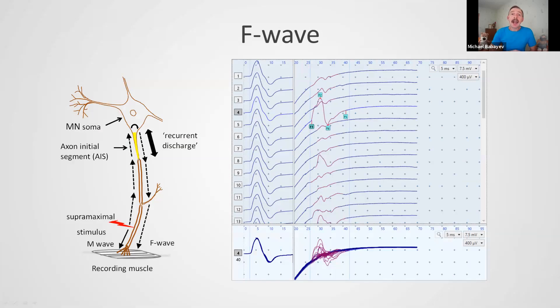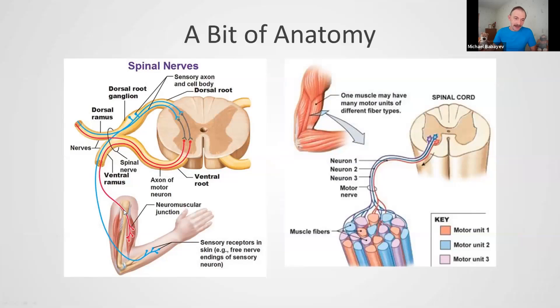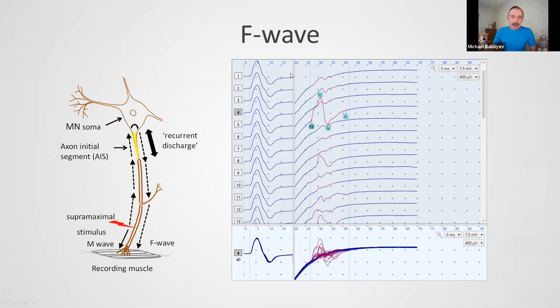Another very interesting and useful technique is the F-wave. If you apply an electrical stimulus on the motor fibers of the nerve, excitation goes to the muscle and the muscle contracts. But at the same time, the signal also travels up to the spinal cord to the motor neuron. Sometimes this motor neuron can be excited and sends a signal back to the muscle, and we can record this late response — it is the F-wave. In the picture you can see a few stimuli applied; the superimposed traces show that the first responses (CMAP) are identical, but the second responses (F-wave) differ from each other because the F-wave is not stable.